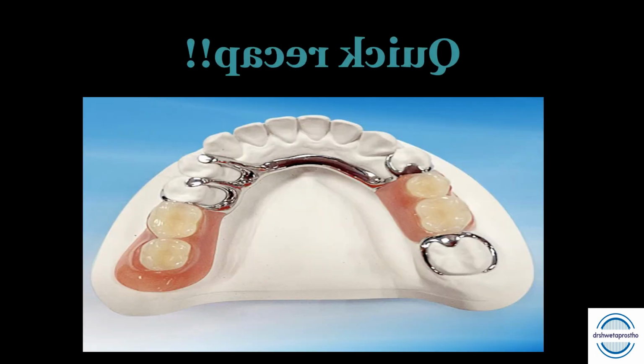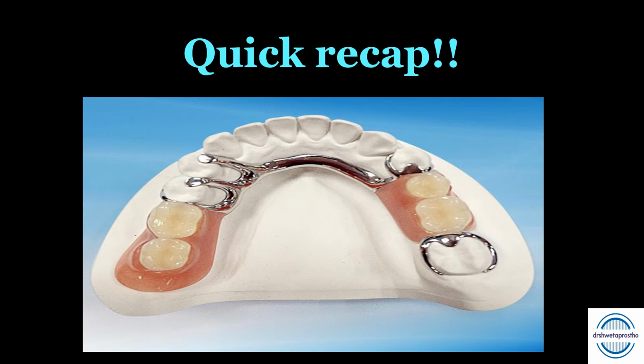Now let us quickly summarize all the parts in this cast partial denture. First, let's begin with the major connector. This is the major connector. It is a lingual bar major connector which is connecting one side of the components to the other side. Then we have the minor connector. This is the minor connector which is connecting the major connector with the other parts like the rest.